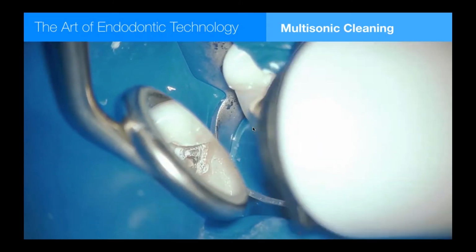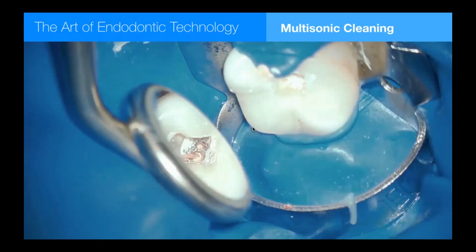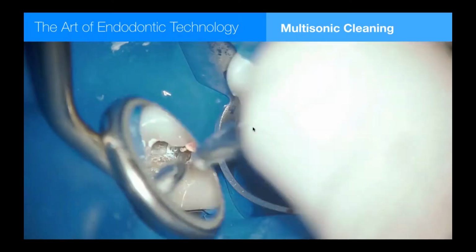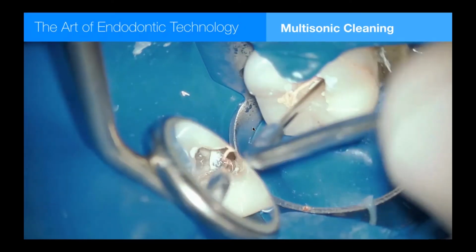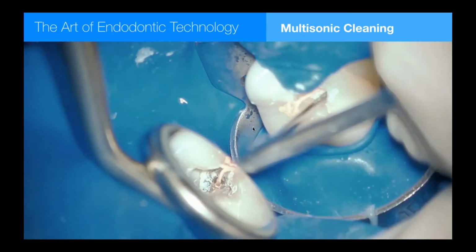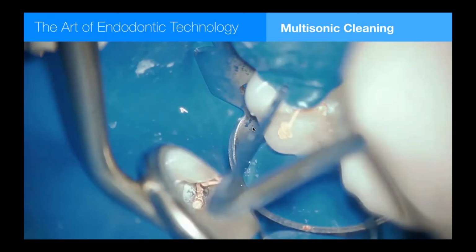We always wait 5 seconds before syringing because we want to heat the needle back up after it's chilled by touching the dentin. It needs to be 160 degrees. The dentin is 37 degrees. So put it in place, wait 5 seconds, and the gutta percha will flow better when you pull the trigger a little bit later. So I'm backfilled just short of the orifice space here.